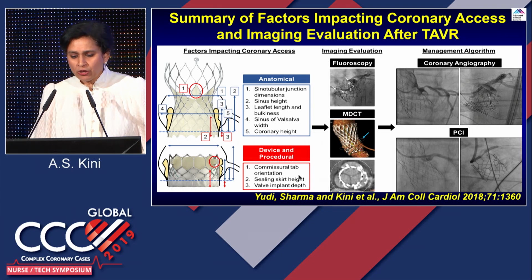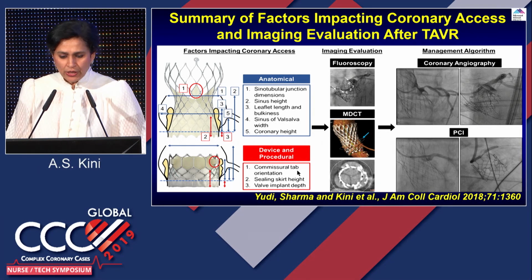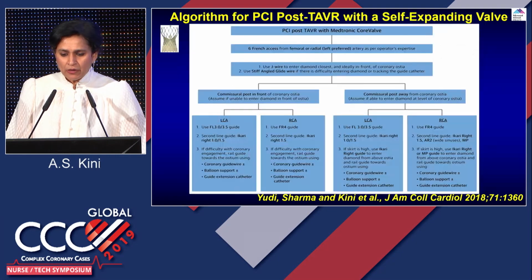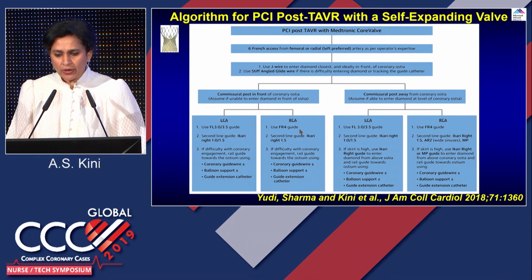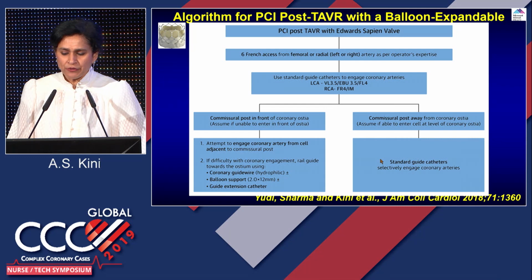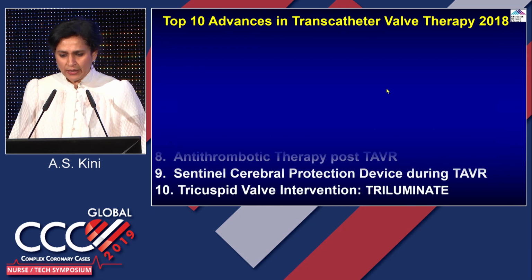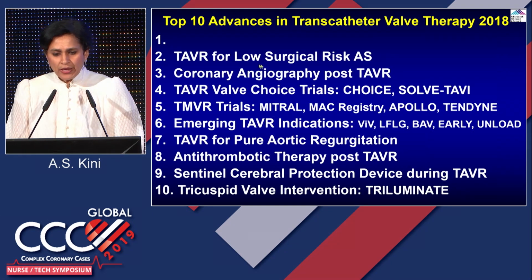And this particular thing resulted in the publication here, and also resulted in the app, which I will show you at the end. And this was the algorithm which we proposed: if you come with this particular valve, which catheter you need to engage, whether you're going to the left side or the right side, the size of the catheters, everything. And this review has been very well cited since then.